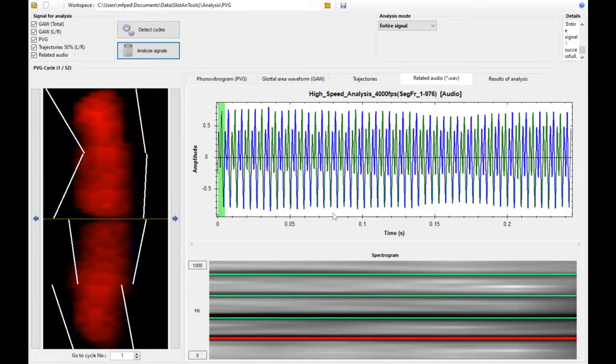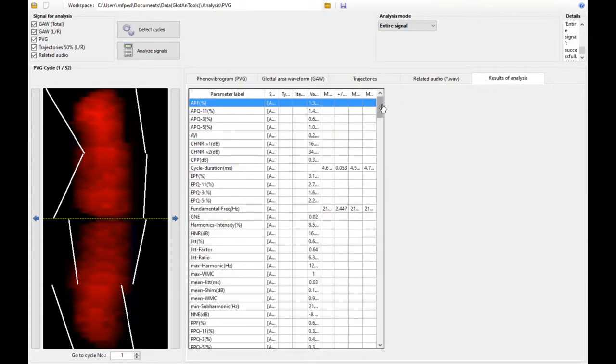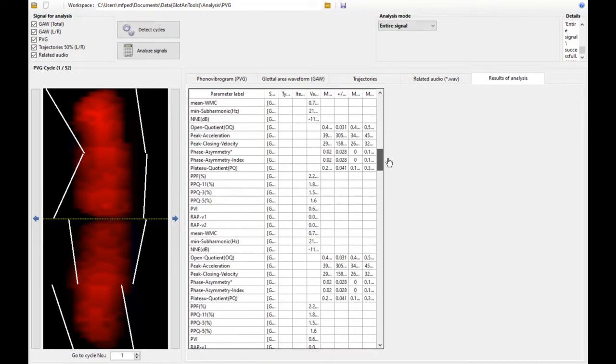The problem with every kind of analysis is to define what you want to measure. But once you have defined it, you have 183 parameters quantitatively, which is a big step forward.